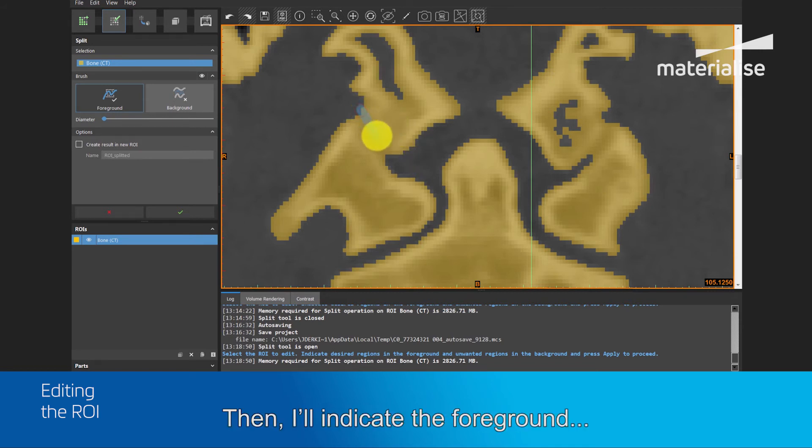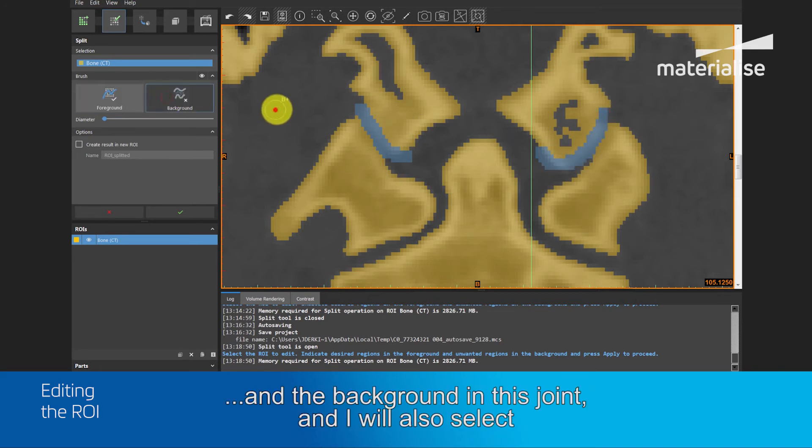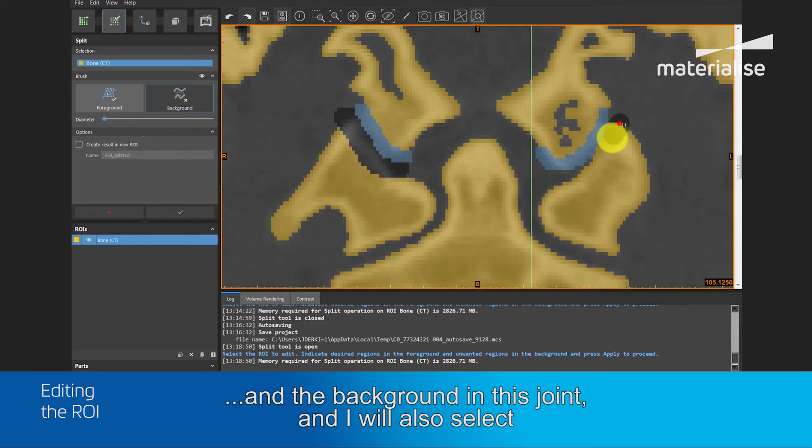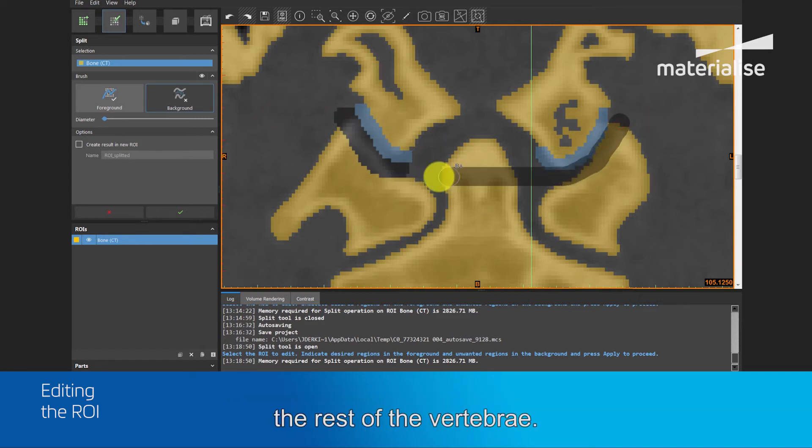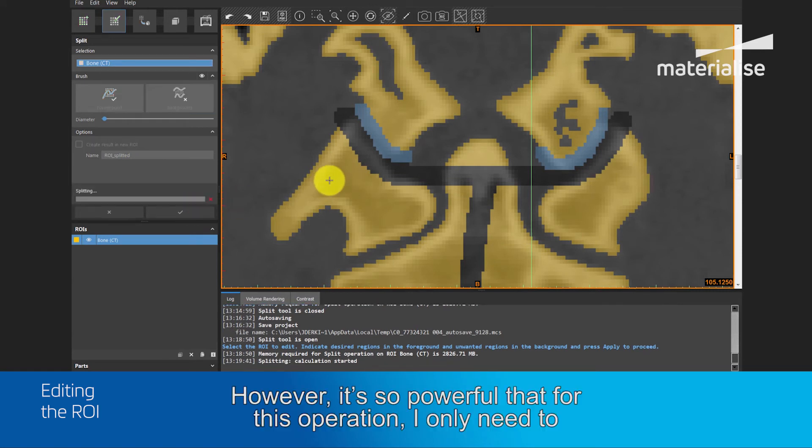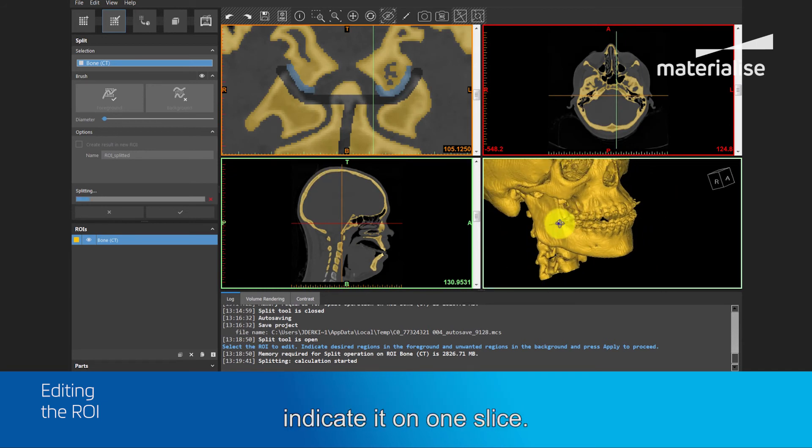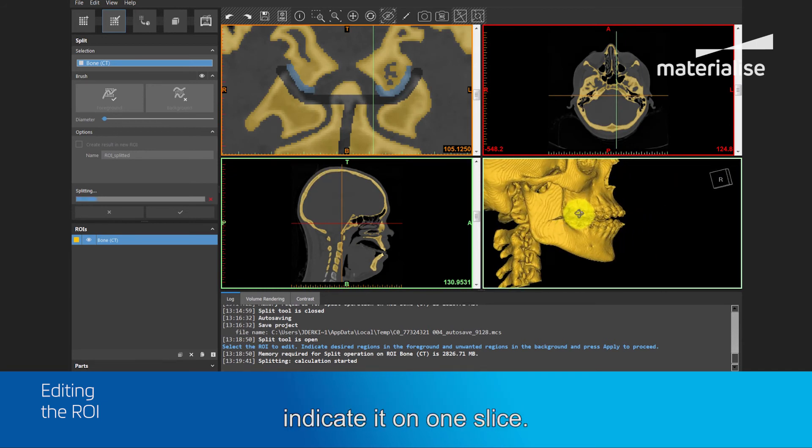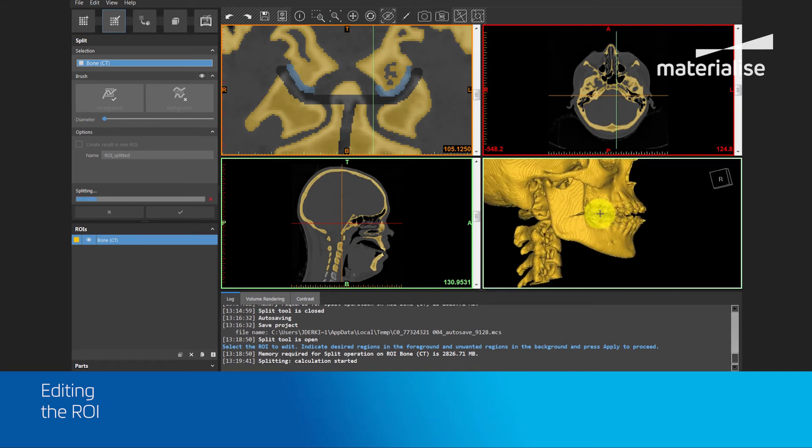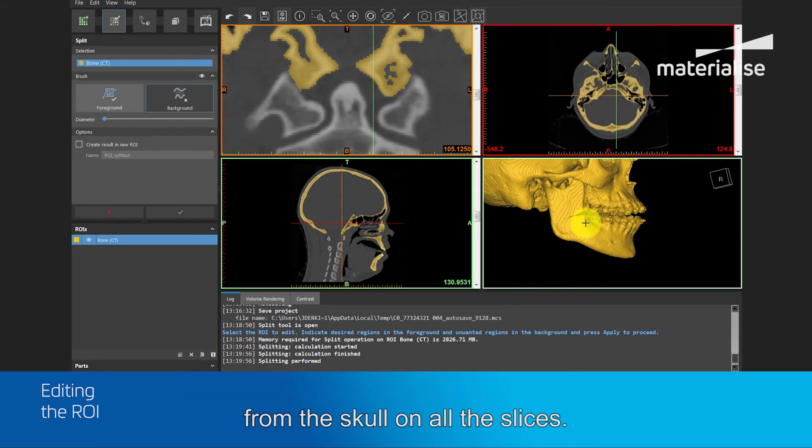Then, I will indicate the foreground and the background in this joint, and I will also select the rest of the vertebra. This tool can be used on multiple slices per iteration. However, it's so powerful that for this operation, I will only need to indicate it on one slice. By clicking the green button, the program will start separating the spine from the skull on all the slices.